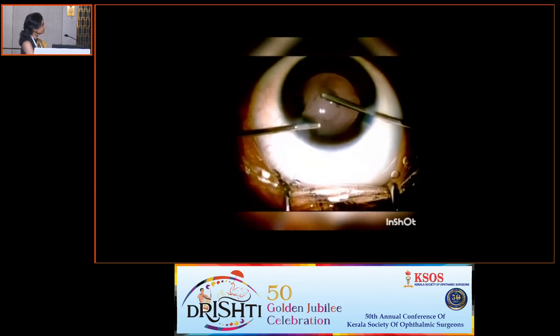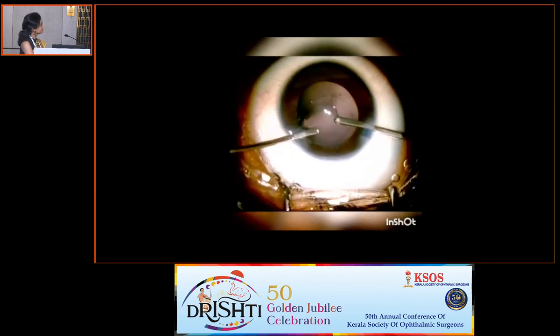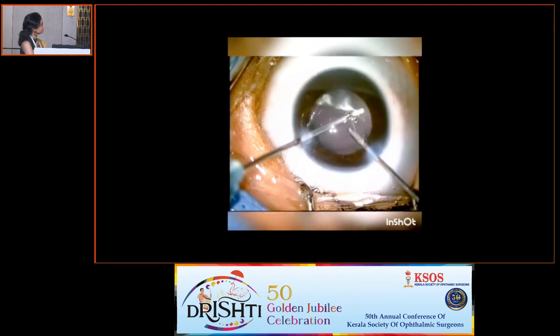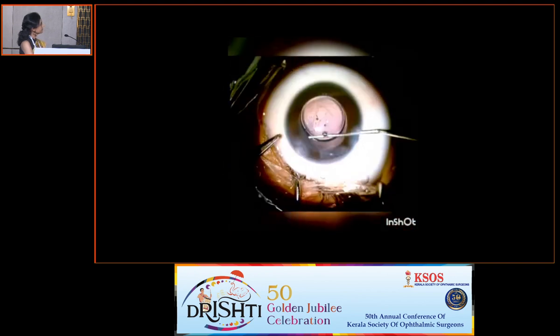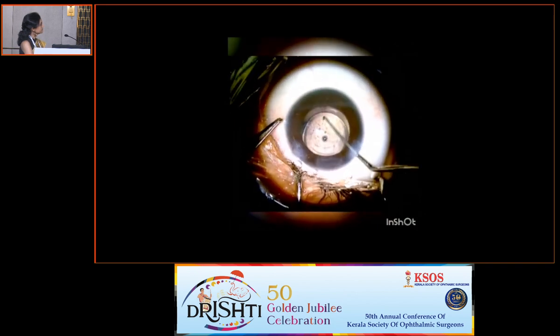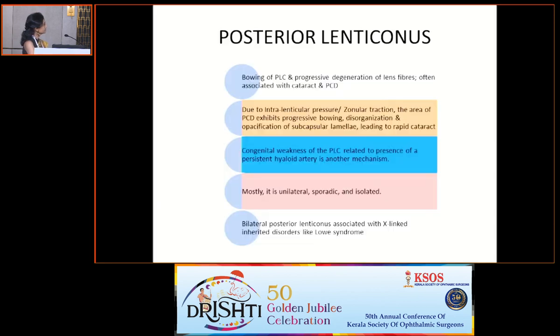And finally, after instilling triamcinolone acetonide to ensure that there is no vitreous in the anterior chamber and in the sections, we proceeded with an intraocular lens implantation. You can see the anterior segment being cleared of the triamcinolone, and the 3-piece intraocular lens is being implanted. It is dialed into the sulcus, and the optics are captured under the anterior capsulorhexis. And finally, after removing the viscoelastic, the eye was closed.